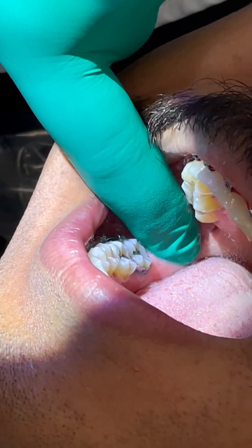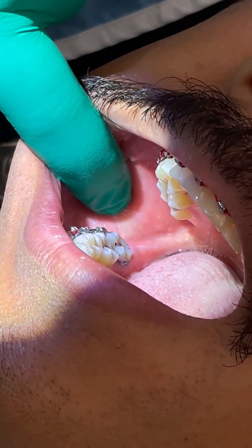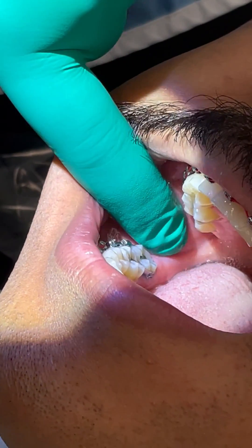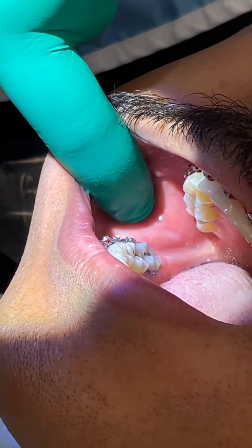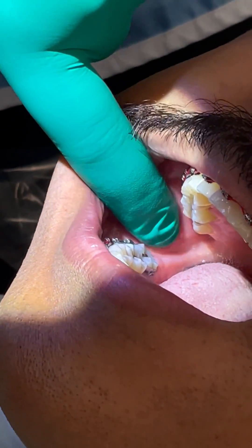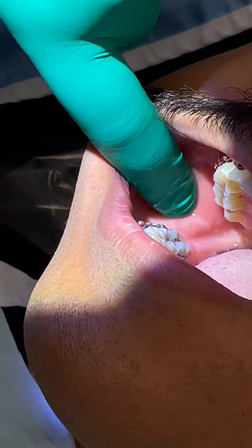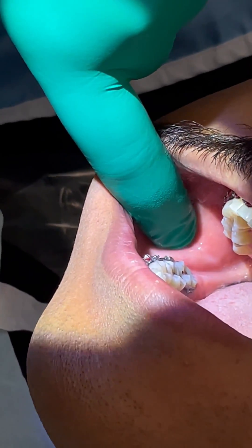That's about where you're going to give it — one on the inside, one on the outside. What I do is just kind of puff the tissue up, because sometimes this tissue can be really thin and you can't even get a millimeter of injection site. So you just go to the coronoid notch right here and puff up the tissue.